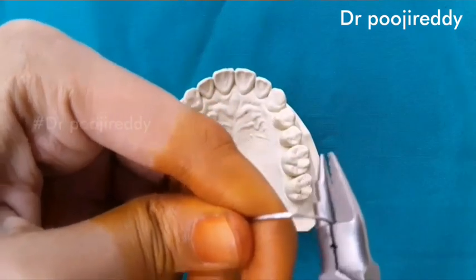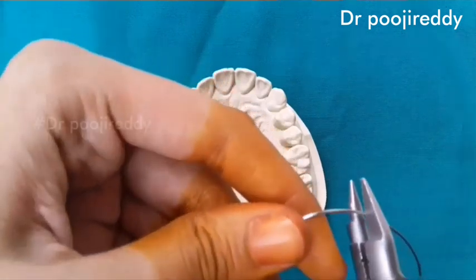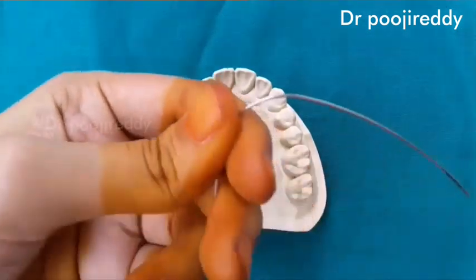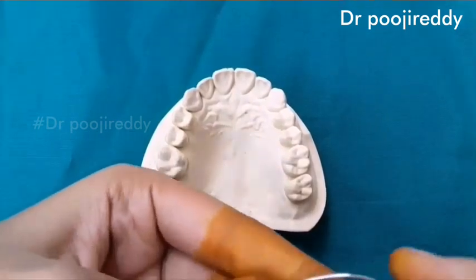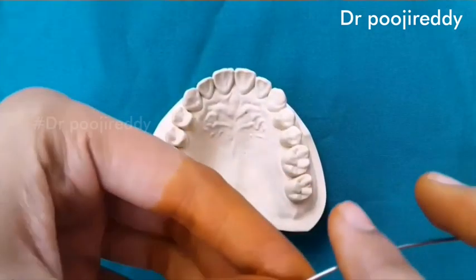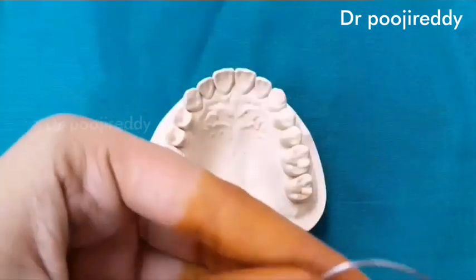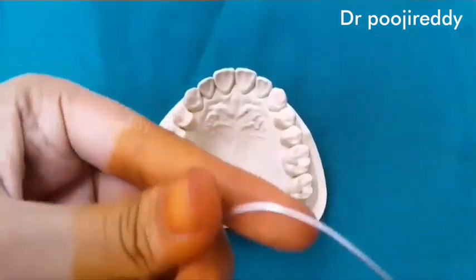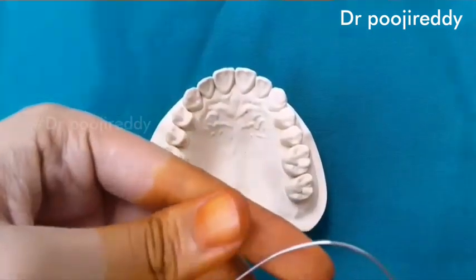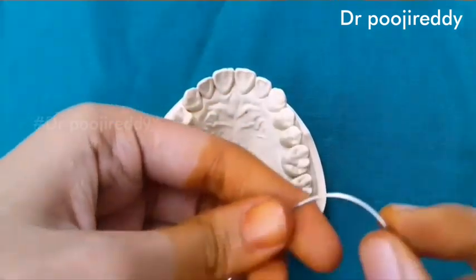With a universal plier, just give a slight bend. While fabricating the coffin spring, you should always remember that the bend should be very light and it should not be very sharp. There should not be uneven surfaces around the coffin spring.